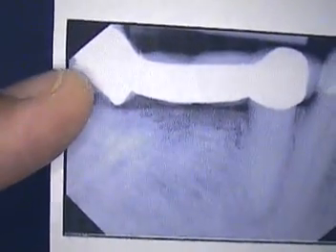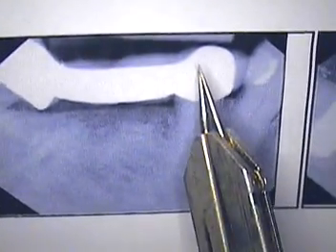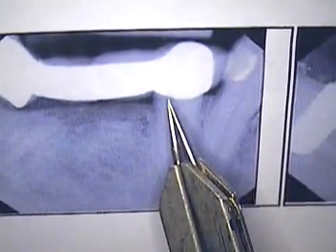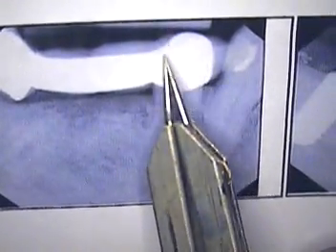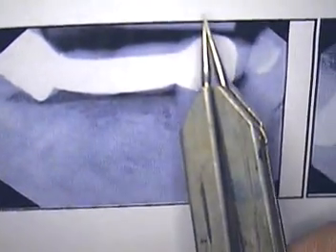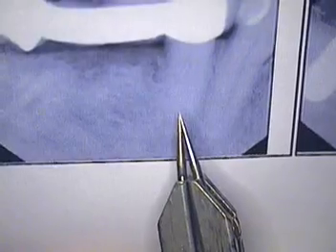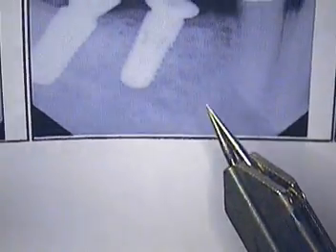The old root canal treated tooth has failed and the periodontist sectioned distal to the 28 abutment. We talked before about how he sectioned it — since he was placing the implants more on an angle, he could have sectioned it more on an angle to follow the path. Possibly the guide pins could have helped him a little bit in this particular case. There's certainly a lot of bone and width of bone here.